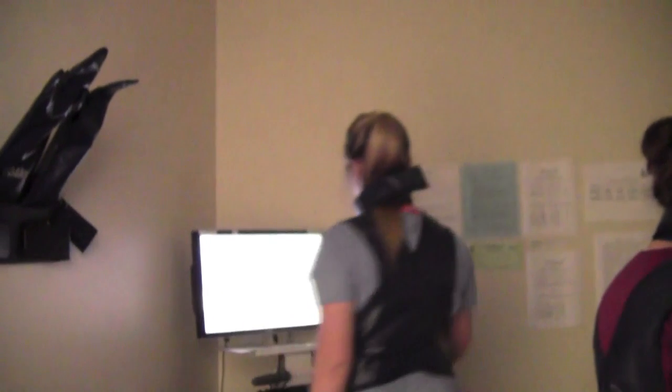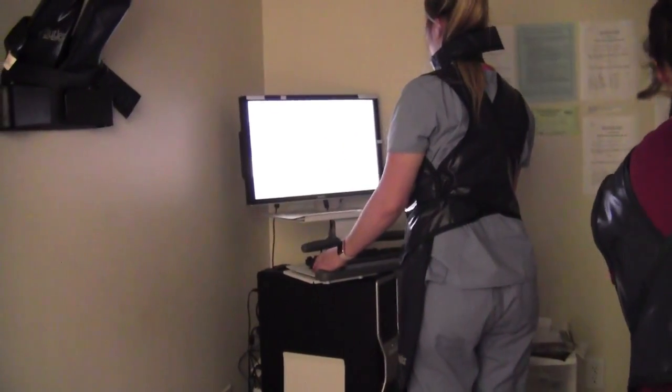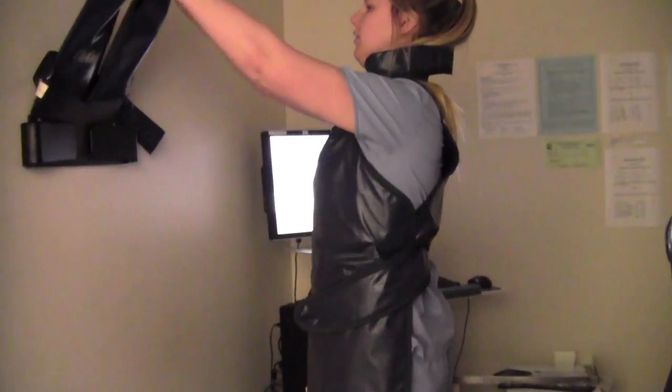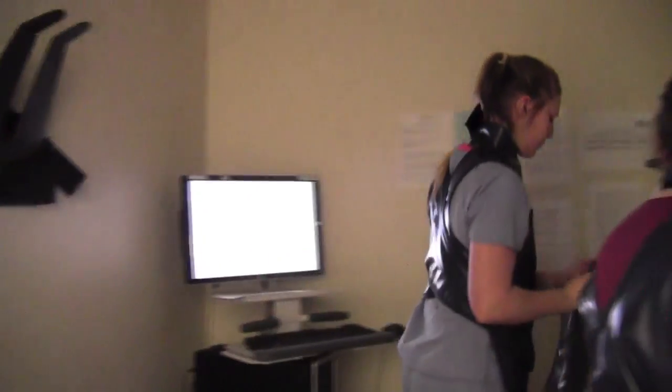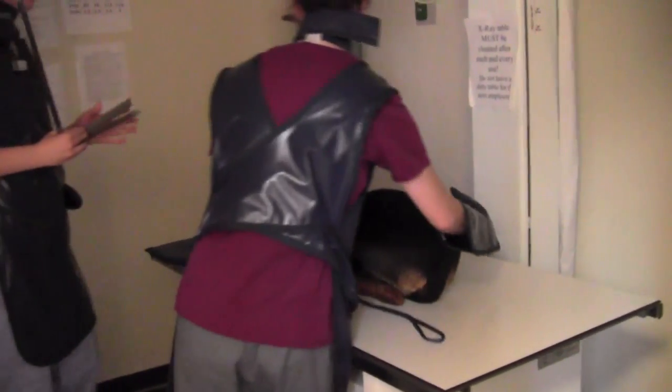Abdominal x-rays are used to evaluate soft tissues of the abdomen, such as the kidney, bladder, liver, and intestines. Once I have placed the patient's information into the computer and selected what type of x-ray I will be taking, I will measure the patient at the highest point, usually around the 13th rib.